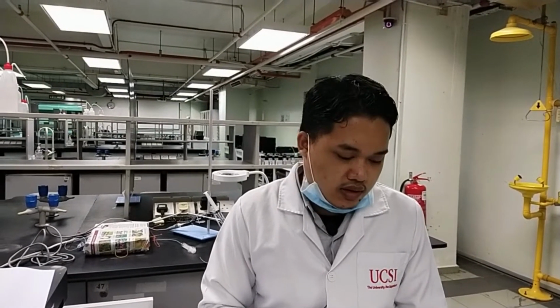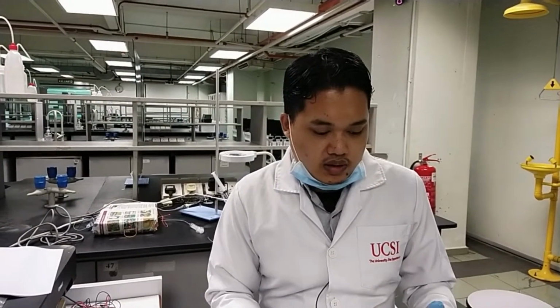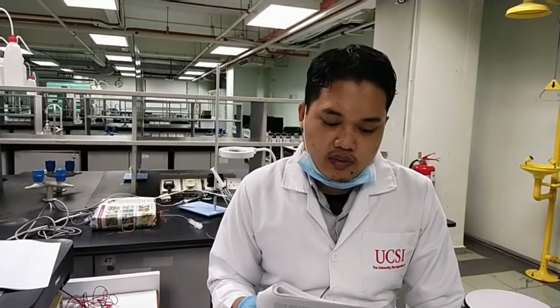For today I'm going to give you a demonstration for the subject cardiovascular system, blood and also pharmacotherapy. I'm going to focus more on practical number 4, which is the cardiovascular system of the rats. We are going to study the influence of baroreceptors. The second one is to study the effect of vagal nerve stimulation by applying electrical stimulation to the vagus nerve. And the third one is to study the effect of various drugs on the blood pressure of the rats.